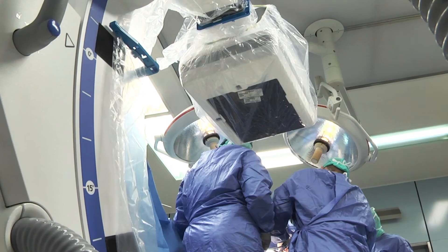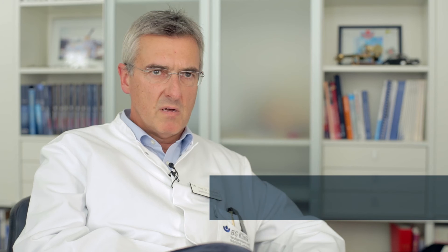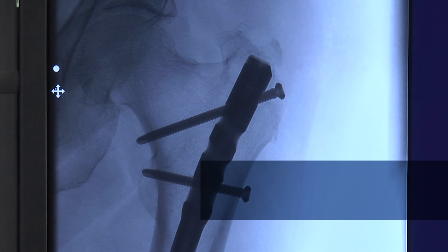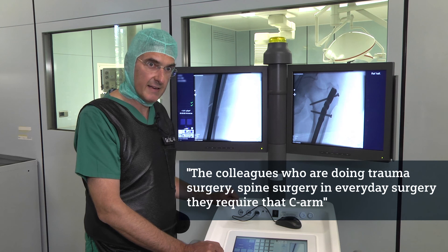From my point of view it was interesting to see that the Seuss Fusion provides features that were not available in standard C-Arms in our orthopedic and trauma theatres. We now have this flat panel technology available — hopefully in the future for every trauma room and every orthopedic intervention. I have to admit I have never seen such good bony structure in an intraoperative image. The colleagues doing trauma surgery and spine surgery in everyday practice — they require this C-Arm, and if they can get it, they want to have it.